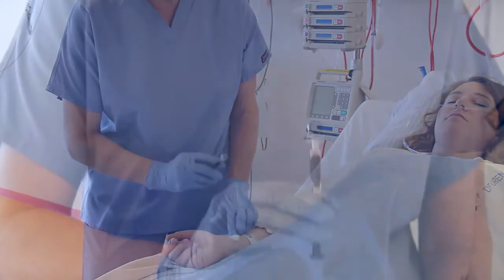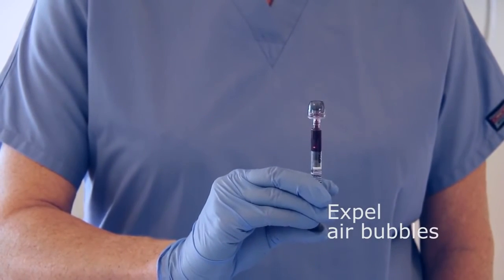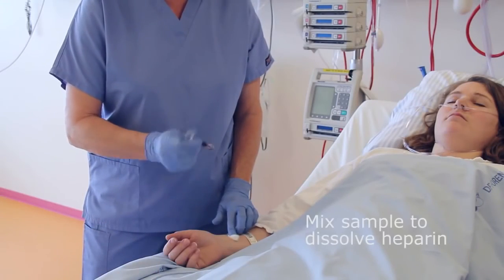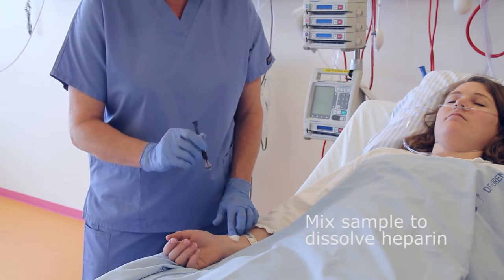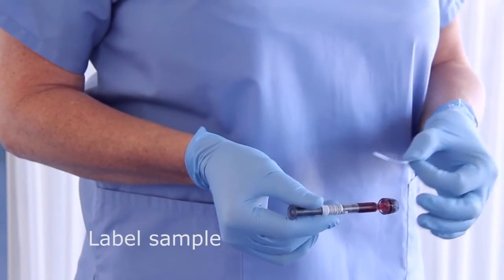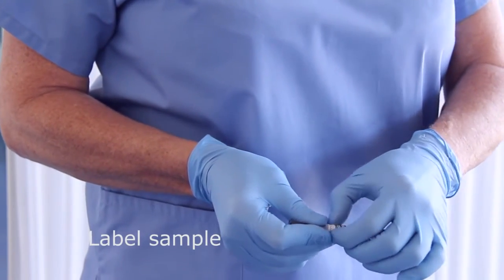Gently tap the syringe so that air bubbles are forced to the top. Expel air bubbles through the tip cap or into a gauze. Mix the sample thoroughly to dissolve the heparin. Label the syringe with patient ID and immediately transport the sample to the blood gas analyzer.